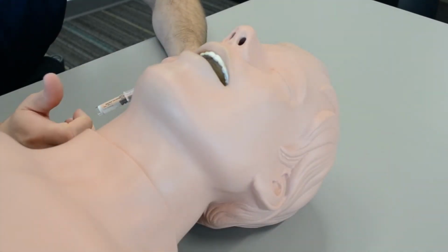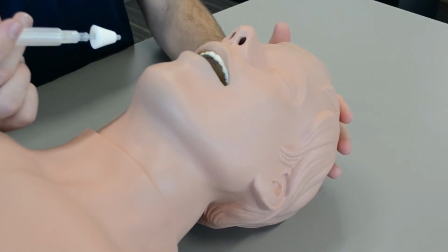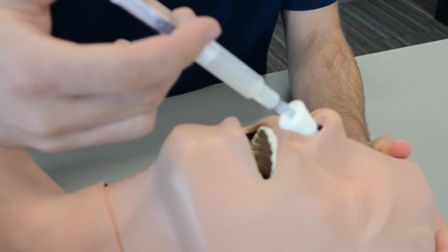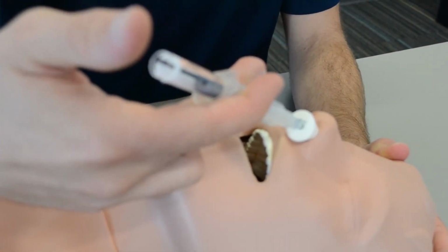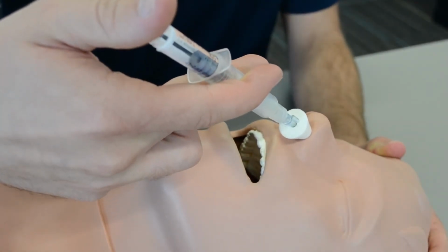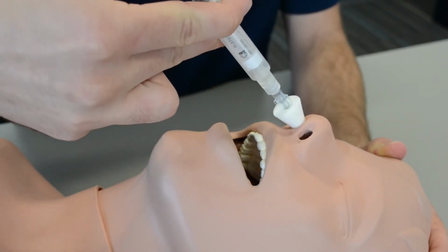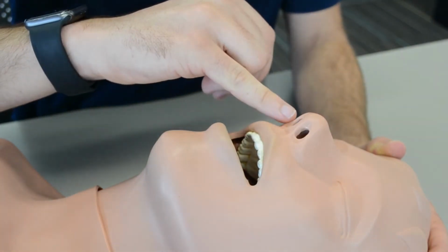Okay, so now that we're ready to give our Narcan, we want to position our patient in the best way possible to receive it. It's going to go inside the nostrils. We're going to aim for the nasal mucosa where it's actually going to be absorbed. So we're going to ever so slightly tilt their head backwards. The way that we would deliver this Narcan is 1 milligram in each nostril. So 1 milligram is 1 mL. You'd very rapidly push the first mL. Speed is important because you need to have enough pressure to actually atomize the material. So we give the first mL in one nostril, the second mL in the other nostril.